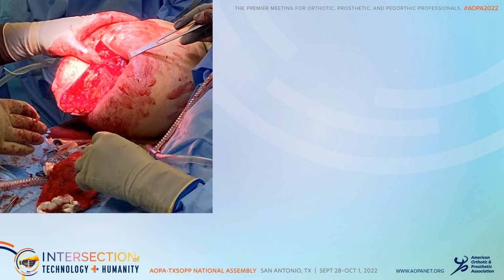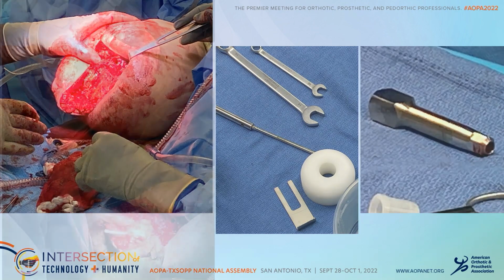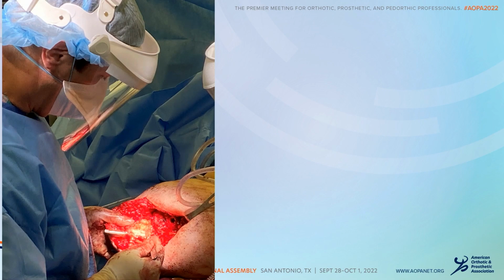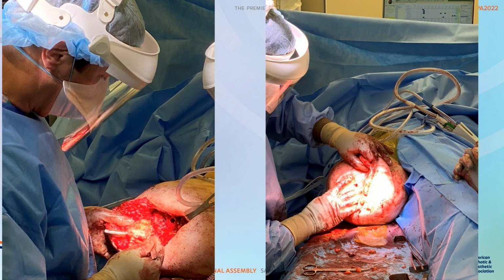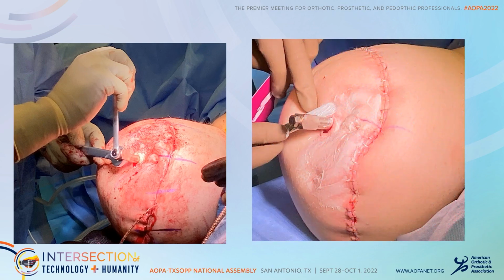The stage 2 procedure is actually the larger procedure. It's the creation of what we call a fasciocutaneous flap. So it's a large soft tissue envelope that we elevate. We create what's called a muscle platform, where the muscles are attached to the bone, about 1 centimeter proximal to the distal end of the bone. And then we thin out the soft tissue envelope where the skin penetration site is to create a full thickness skin graft that then grafts itself and attaches itself to the bone distally, and of course bring the abutment or the percutaneous portion of the implant through the skin.